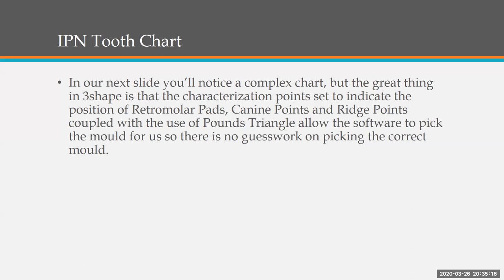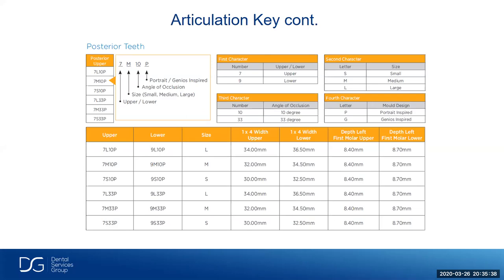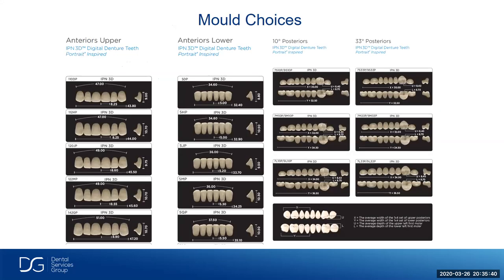And the canine points and ridge points are coupled with the use of Pound's triangle, allowing the software to pick out the denture teeth. And so there's no guesswork in picking out the correct mold. So there's your articulation key, and all that information is in the software. So it takes into consideration the bite registration, the shape of the arch, the impression that was taken, and it tells us what denture teeth to use. So it's really neat the way this is done, and it saves us a lot of trouble. And there's a lot of different mold choices we can choose from.